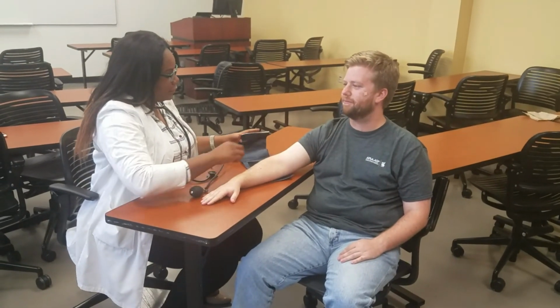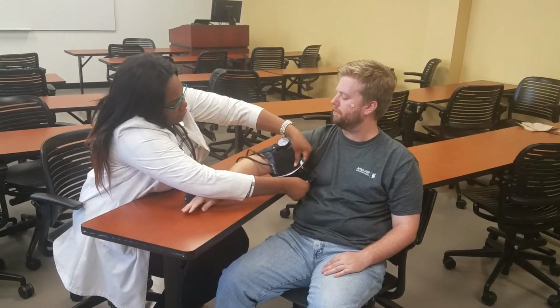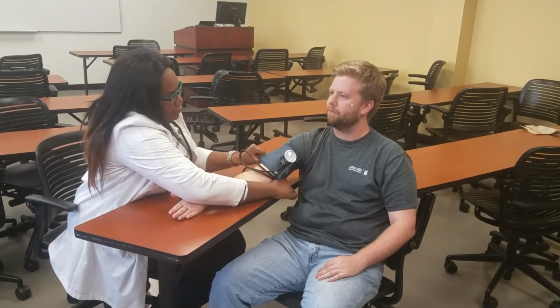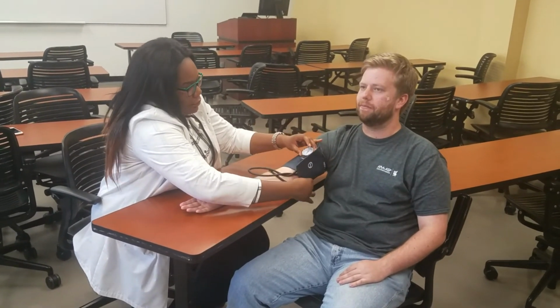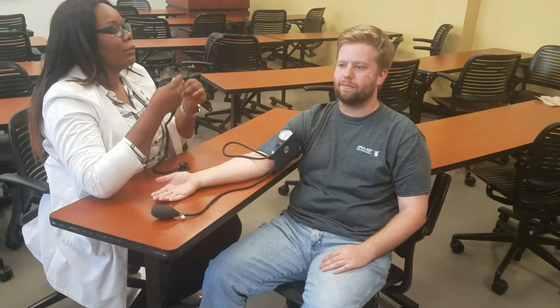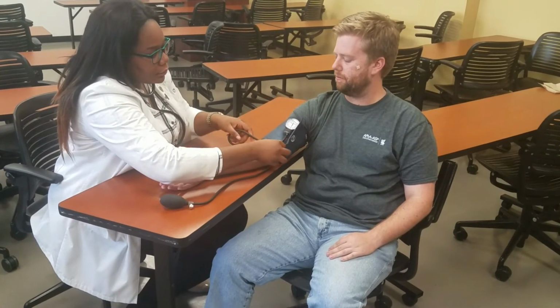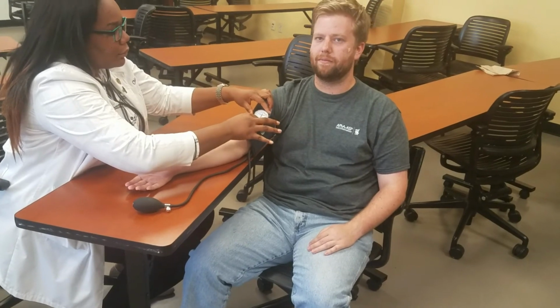Step 4 is the actual blood pressure reading. The pharmacist will place the blood pressure cuff on the patient's arm, making sure that it's not too tight or too loose, and that there is an appropriate cuff size for the patient's arm. To make sure that the arrow stating artery is directly over the brachial artery.